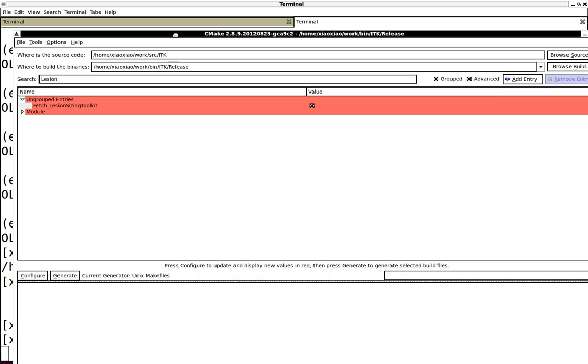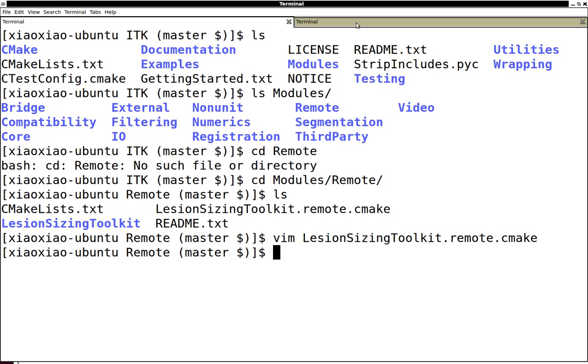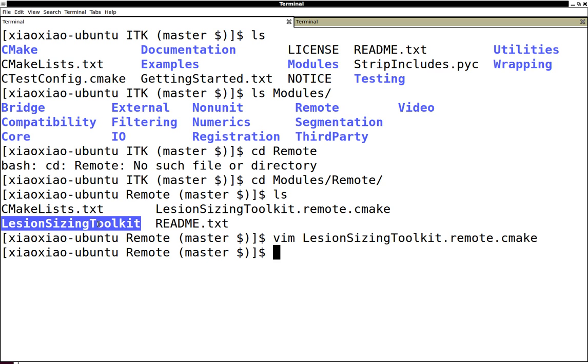First of all, you need to turn on the fetch Lesion Sizing Toolkit CMake variable. This will automatically use this little CMake code we have and then fetch the code repository and download the Lesion Sizing Toolkit source code into this folder.